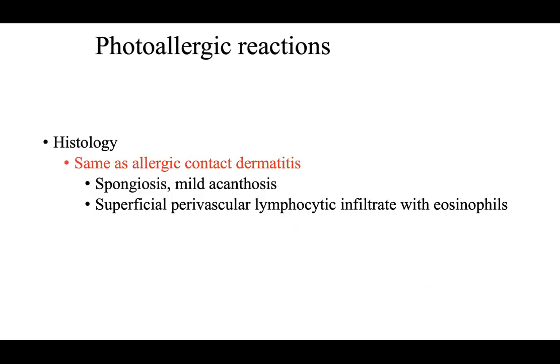Photoallergic reactions show, on the histology, a very similar picture to allergic contact dermatitis. So if the clinician gives you a photoallergic versus allergic contact, well, you're going to have to ask them to clinically correlate with the medicines the patient's on and the distribution of how it's actually presenting. If you have access to the EMR and the images, you can do the investigation yourself and see how they documented it, how the patient presented, and help you differentiate those two. But if you don't have enough clinical information, you can still say that it could be an allergic contact or a photoallergic, depending on the clinical scenario.